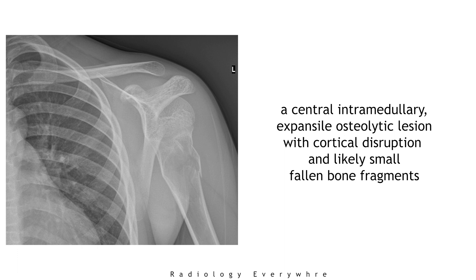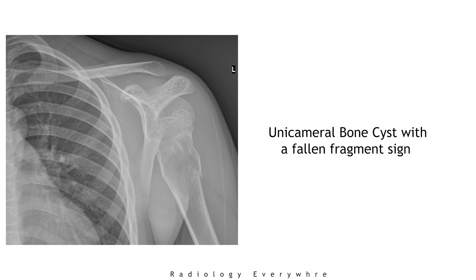This frontal x-ray of a left shoulder shows a central intramedullary expansile osteolytic lesion with an associated cortical disruption and osseous linear fragment in the dependent portion of the lateral aspect. This is consistent with the fallen fragment sign of a unicameral bone cyst.